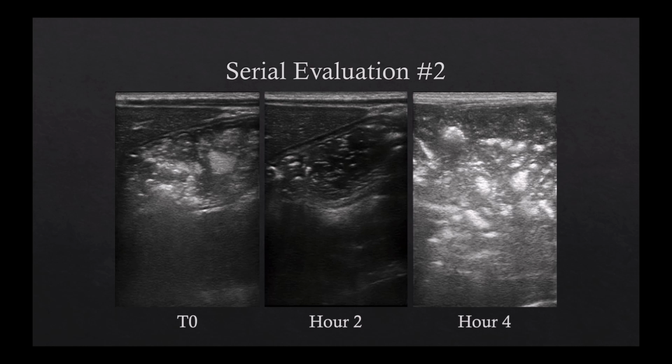In this case, the patient had a little bit of a snicker on their face. You noted a snack bag in the corner, and they had Cheeto fingers, and you're able to detect the patient had been non-compliant with their fasting in this interval, at which point you can decide either to cancel the case or further delay it as necessary.